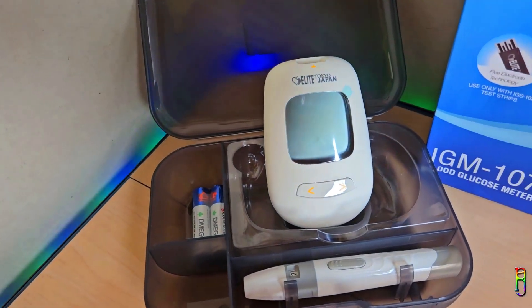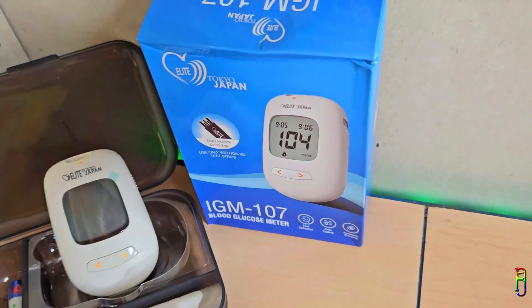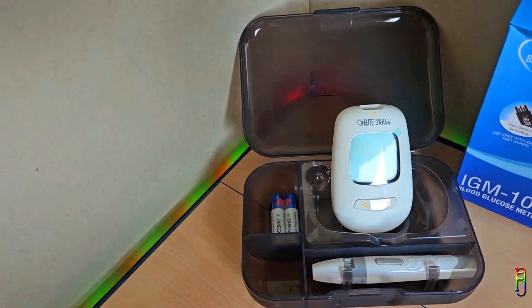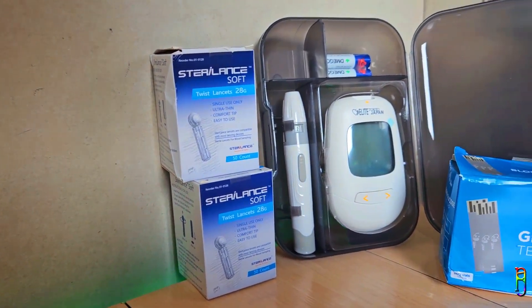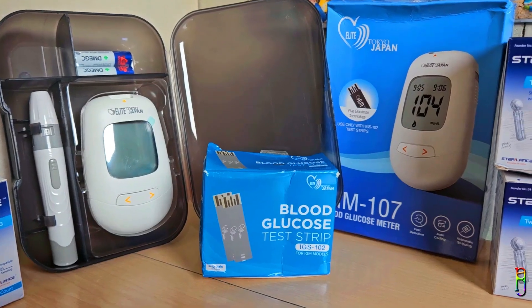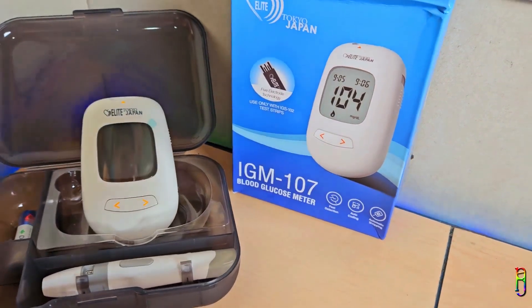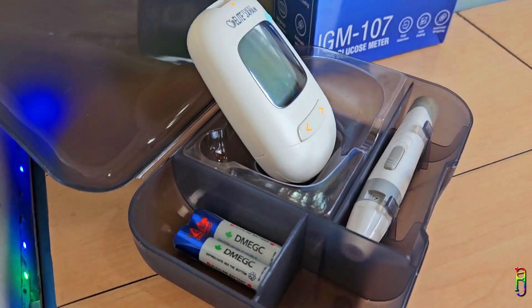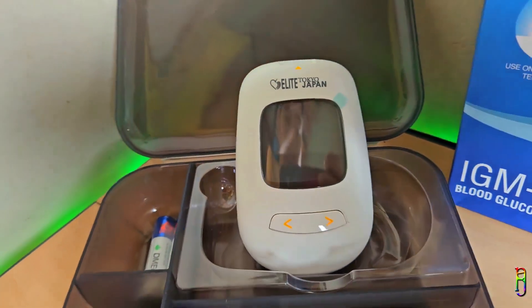I am very happy with my purchase of the Endoplas Elite Tokyo Japan IGM 107 glucometer. I've been using it for more than three months with no issues, and the battery consumption is really optimized — I'm still using the original batteries that came in the box while doing about 12 tests per week combined with my wife. When we eat a lot of sugar or starchy food it gives a high reading correctly, and when I test while starving it gives a low reading. As full disclosure, this is the first glucometer we've ever used, so I watched many comparison videos between top brands like Omron, Sinocare, and Accu-Chek. In most of those videos the Endoplas Elite Tokyo Japan brand consistently produced results closest to Accu-Chek and Sinocare.